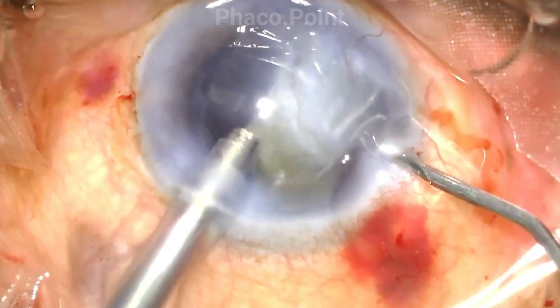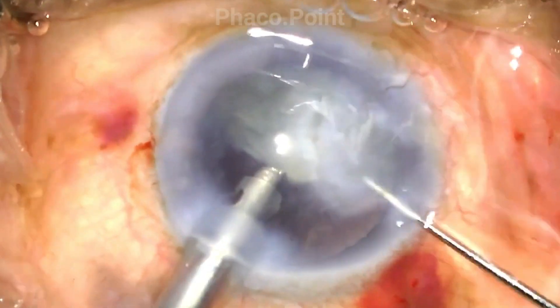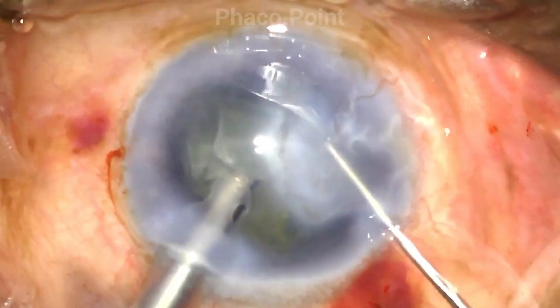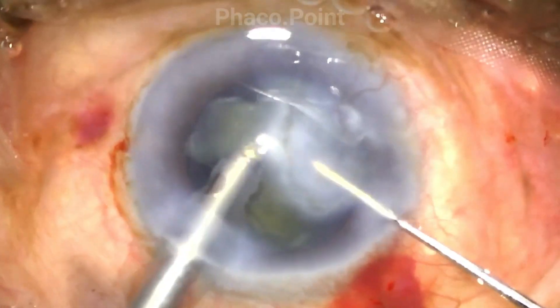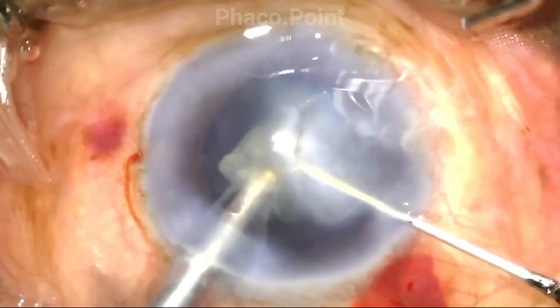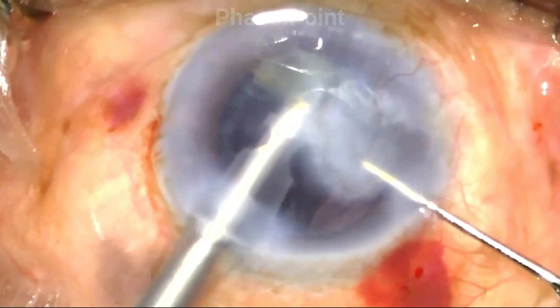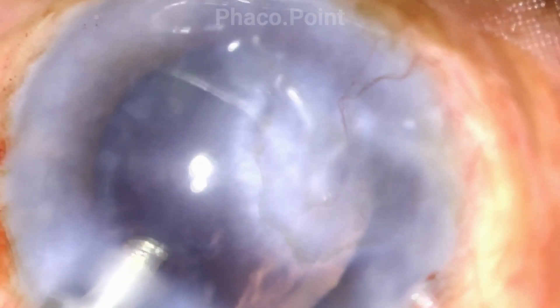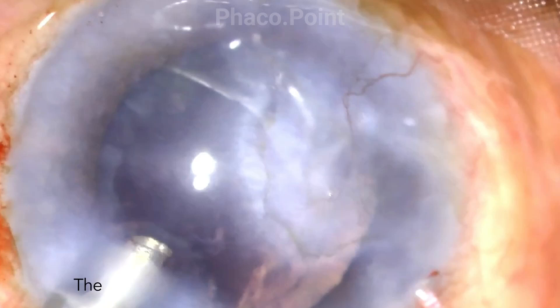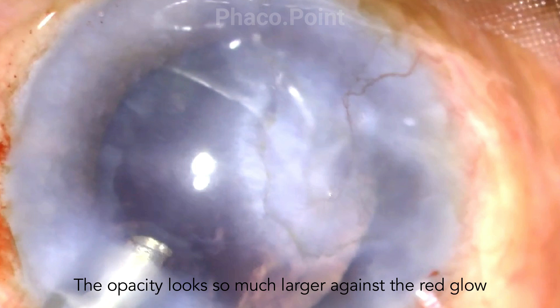What you see now is a visco-fluid exchange prior to the emulsification of the last two fragments. I'd like you to note that when I complete the nucleus emulsification and have a significant red glow coming from behind, how much more obvious the corneal opacity actually becomes.